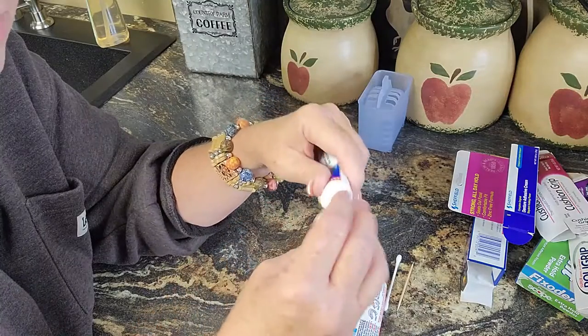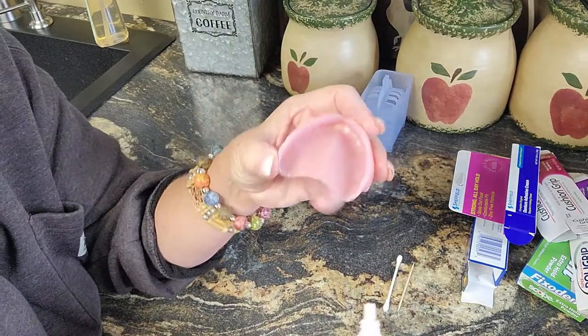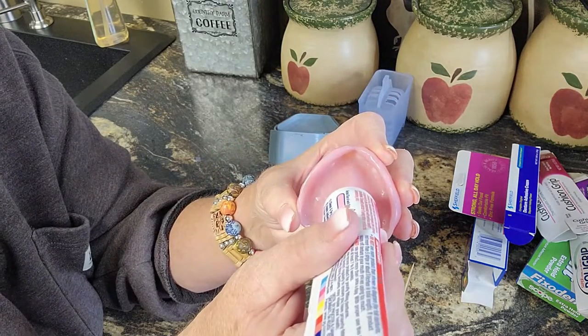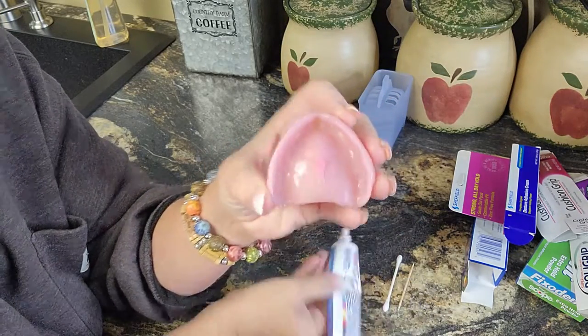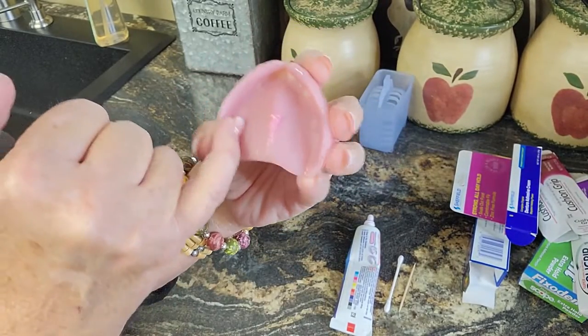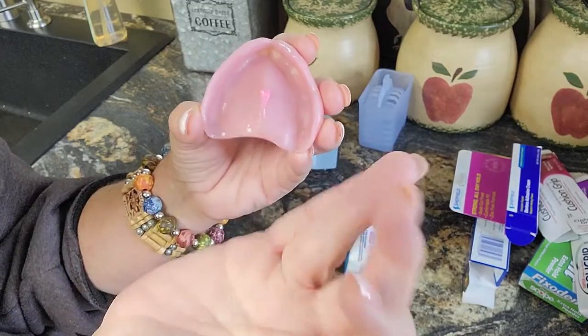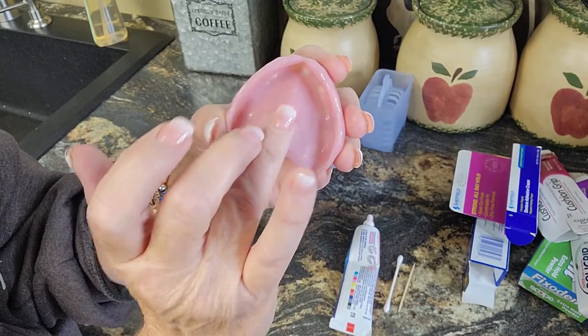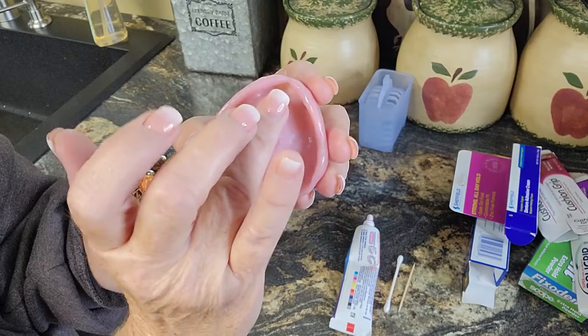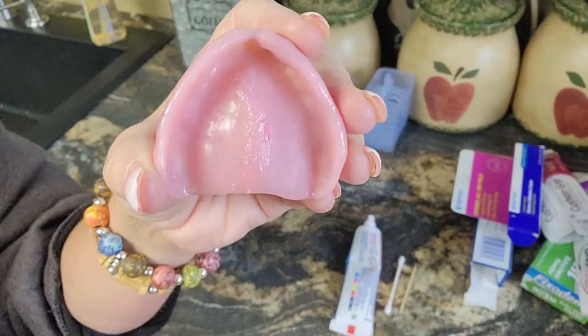Just use a tiny, tiny little bit — I'm talking a tiny little bit. Can you see that? You do not want this to get down in the troughs of your dentures yet. So take your pinky or middle finger, whichever you prefer, and just pat it down through the center — just pat it.